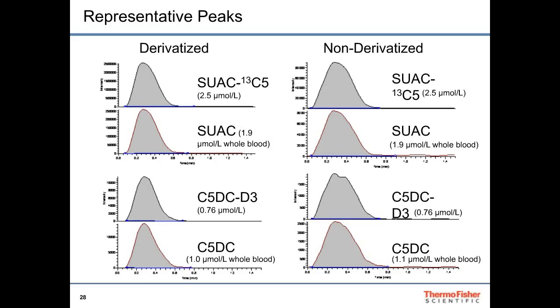One question you may have is, what is the difference in lower limit of quantitation between derivatized and non-derivatized amino acids, as well as the other compounds? These methods are semi-quantitative and do not involve calibration curves or LOQ values. The concentration of each analyte is estimated from its peak area ratioed against its internal standard peak area, and then multiplied by a response factor.